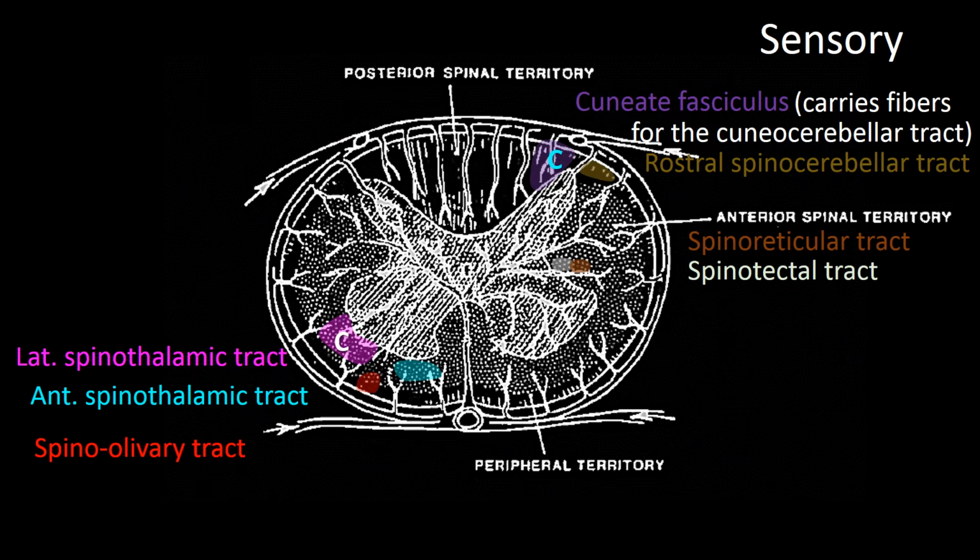Only ascending fibers carrying information from the upper extremity will be activated by upper extremity somatosensory evoked potential. And among them, only those having a relay nucleus at the medulla are likely to contribute to P13-14.